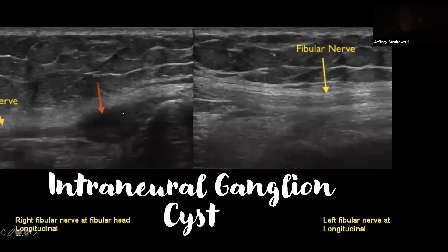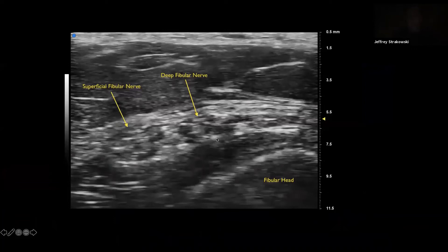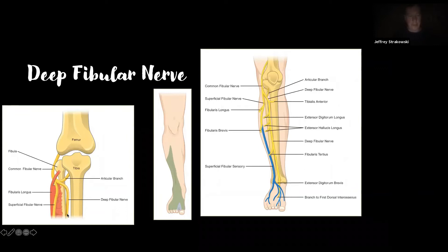Here's an example of an intraneural ganglion cyst — ganglion cysts can come from joints at the tibial fibular joint and into the articular branch, moving up into the fibular nerve and causing a neuropathy. This is one reason to always scan a nerve at this level if you don't have a good reason why they have a neuropathy there. This is the common fibular nerve on the good side by contrast. Getting into the branches — the deep fibular nerve fascicles tend to lead into the fibular tunnel and go quickly deep into the anterior compartment, while the superficial branch goes into the lateral compartment. The articular branch innervates the lateral portion of the tibial fibular joint.